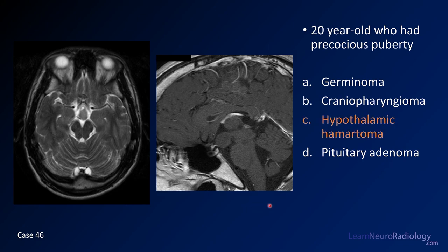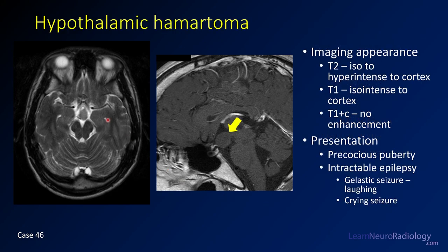This is a case of hypothalamic hamartoma. What you have is a T2 isointense to gray matter lesion in the hypothalamic region. On post-contrast imaging, it remains isointense to gray matter with not much enhancement. It's not centered in the infundibulum and not in the pituitary, so it's probably not an adenoma. A non-enhancing mass in this location is likely a hypothalamic hamartoma.